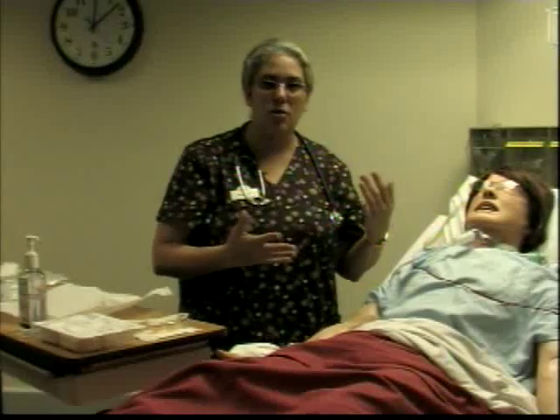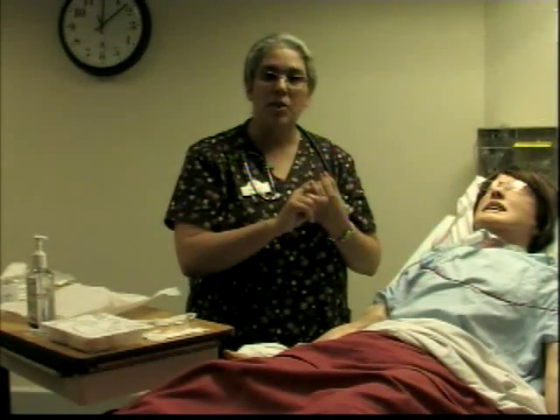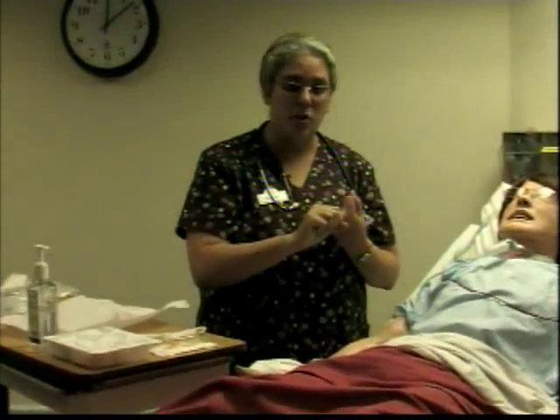Remember, documentation is going to be your set of vitals at the beginning, how the patient's overall condition was, any issues the patient had throughout the procedure, how many passes you went down, the characteristics of the sputum itself: color, consistency, amount, and so forth, and then your reassessment at the end. So this is how you perform a suction in a client with a tracheostomy.